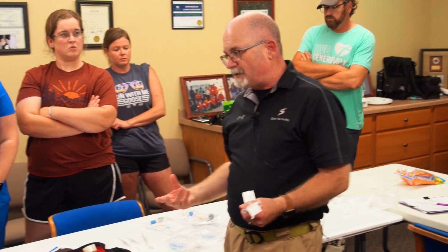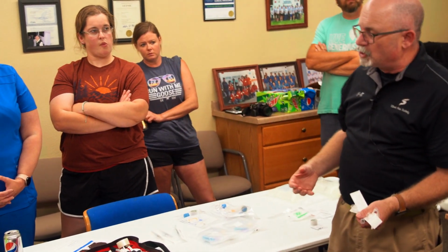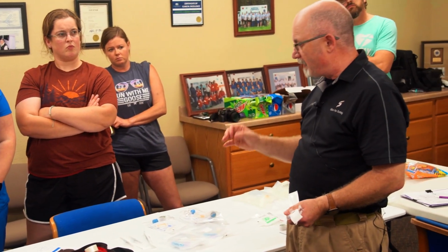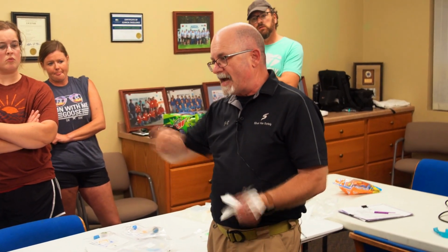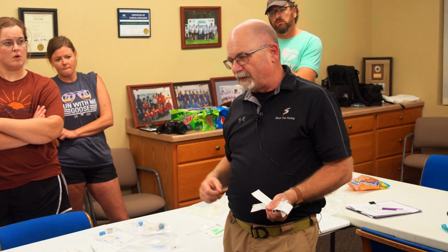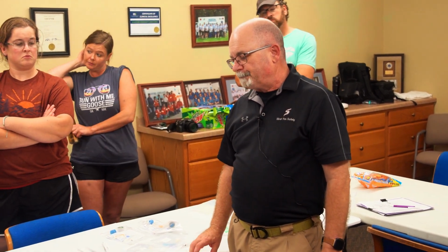Try very hard not to hand a sharps to somebody else. It does happen, but be super, super communicative about it. It's probably better to set it down, and then the next person takes over, so you're not handing it off. Because a needle stick is a big deal. Lots of paperwork. Your immediate risk is still pretty low. So there's that.